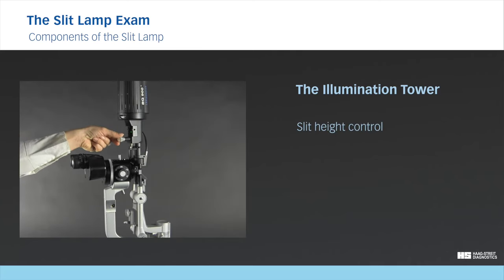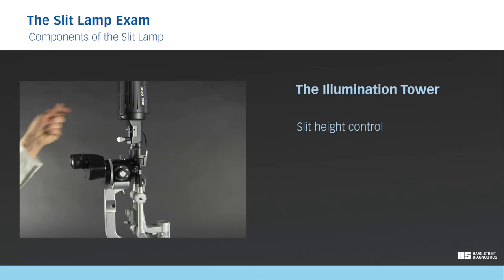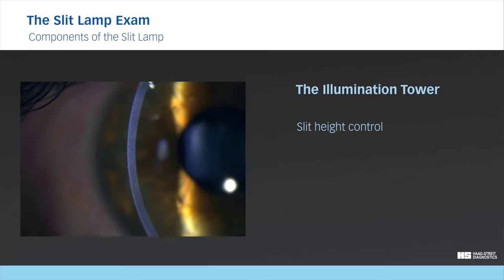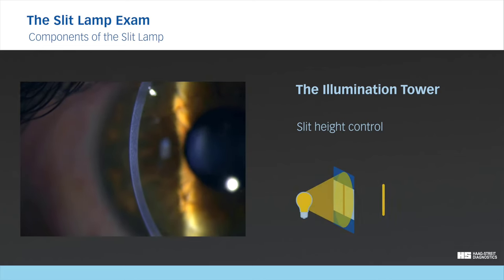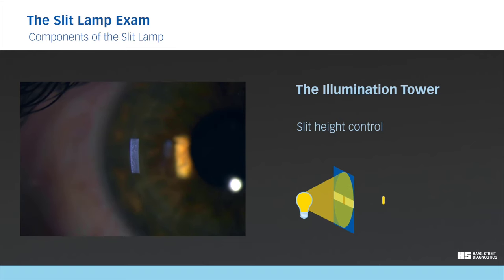By turning the slit height control, the beam can be adjusted from high to short. This is helpful for measuring purposes in and on the eye.